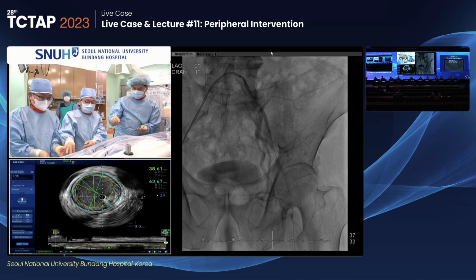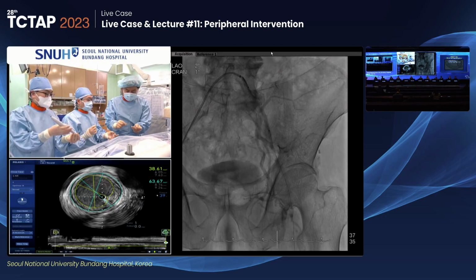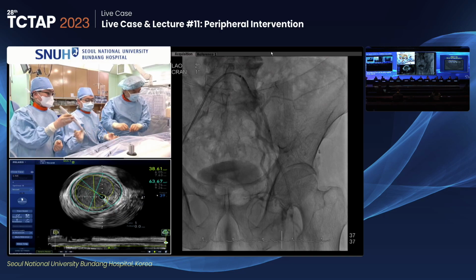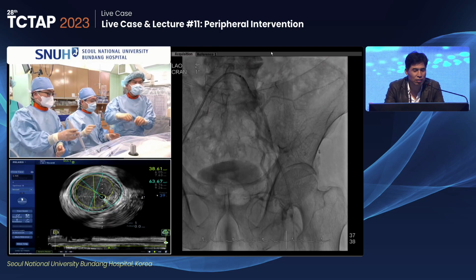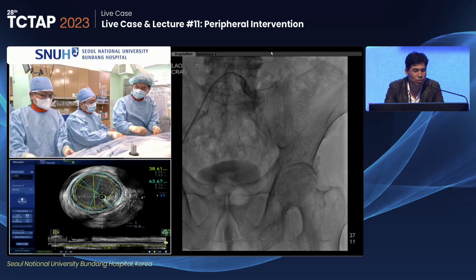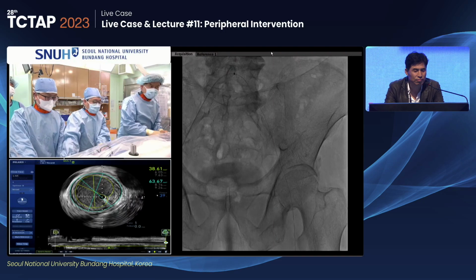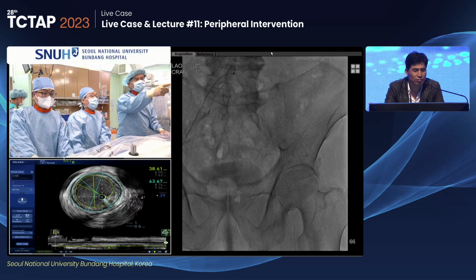It's a bit generous for that distal vessel, but I think distal 10 is okay. Before implantation, it's better to change the guide wire to a 035 system for the safe delivery of the stent. And this is an 018 wire? Show the final image.